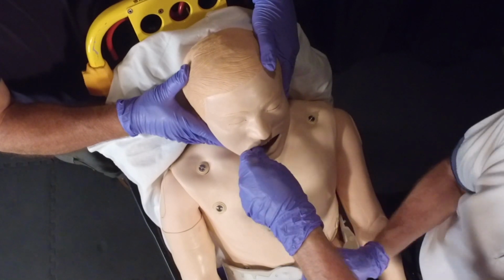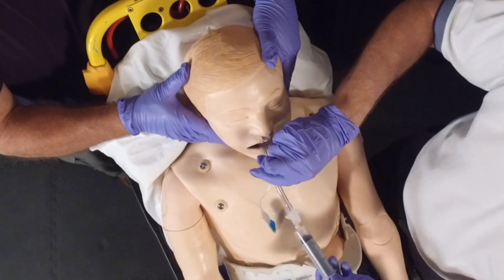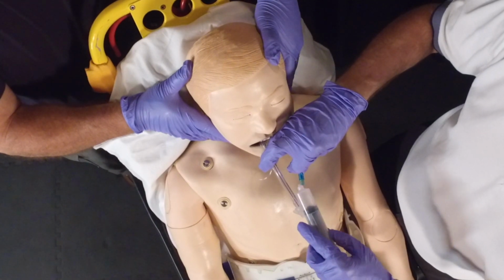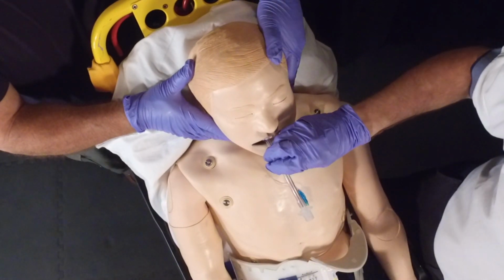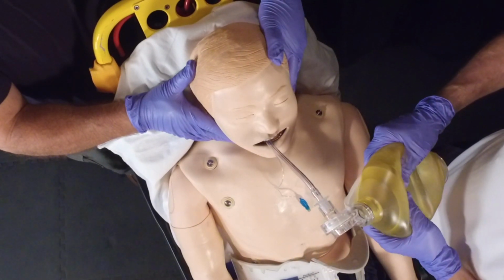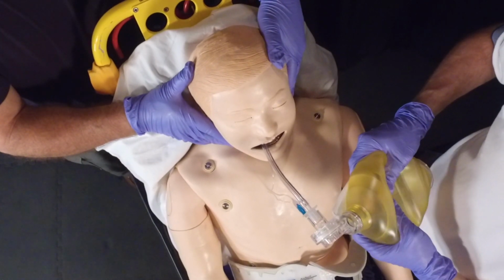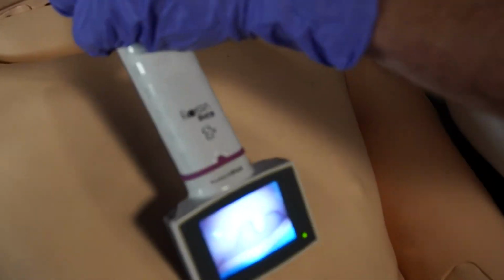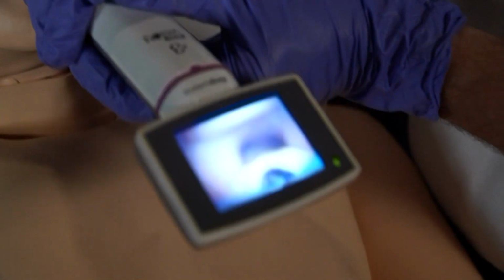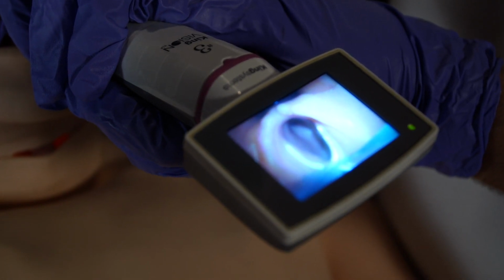Once the tube is in, just like any other intubation, inflate the cuff, apply your ventilation device, listen to epigastric sounds, lung sounds, chest rise, and measure end tidal CO2. Immobilize the tube and the head as you do in any other intubation. Just to give you an idea of how this looks doing the intubation from the front, we've placed a video camera laryngoscope in the same position.